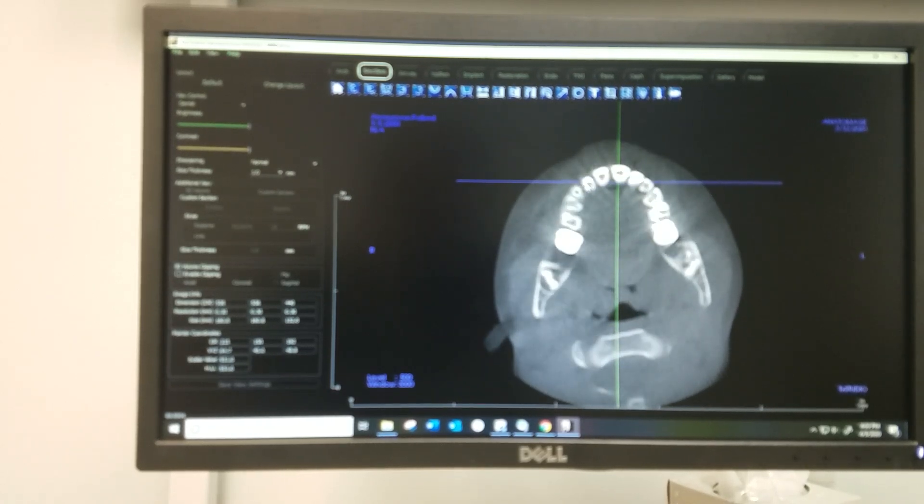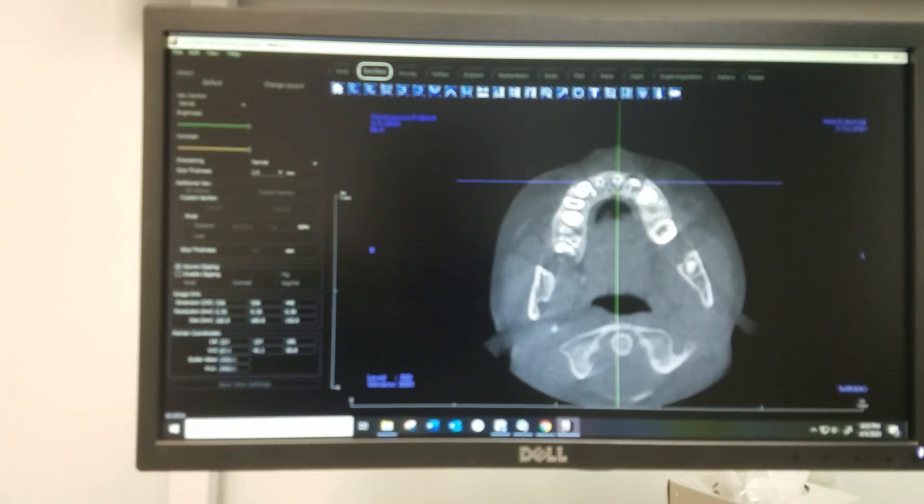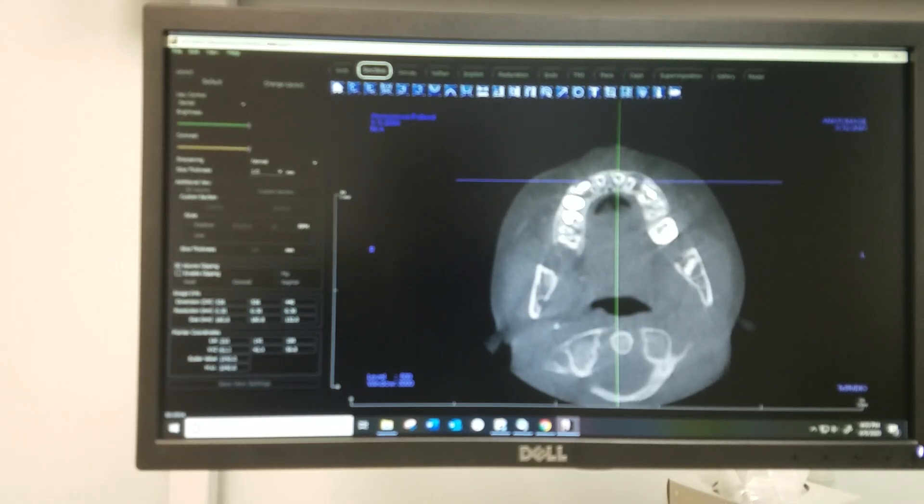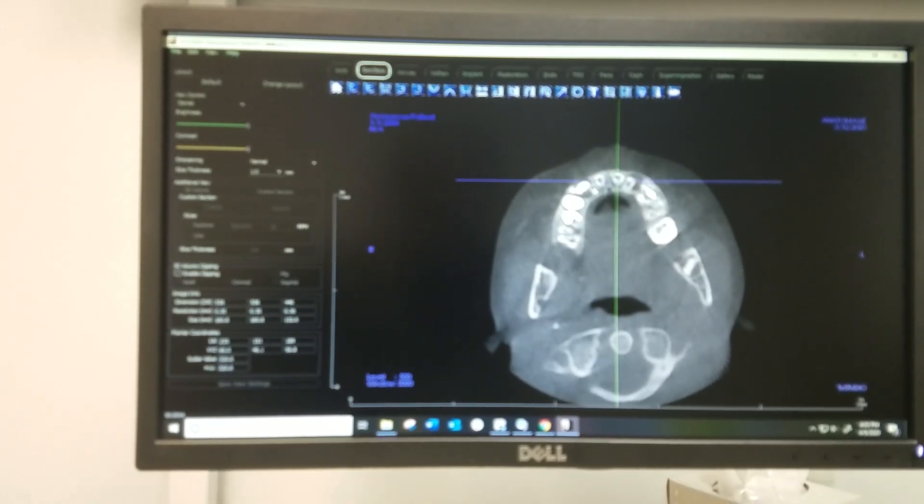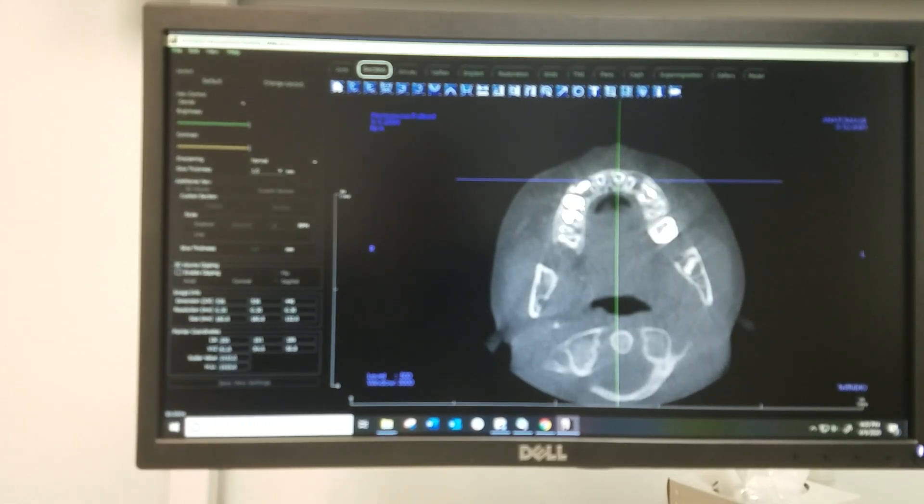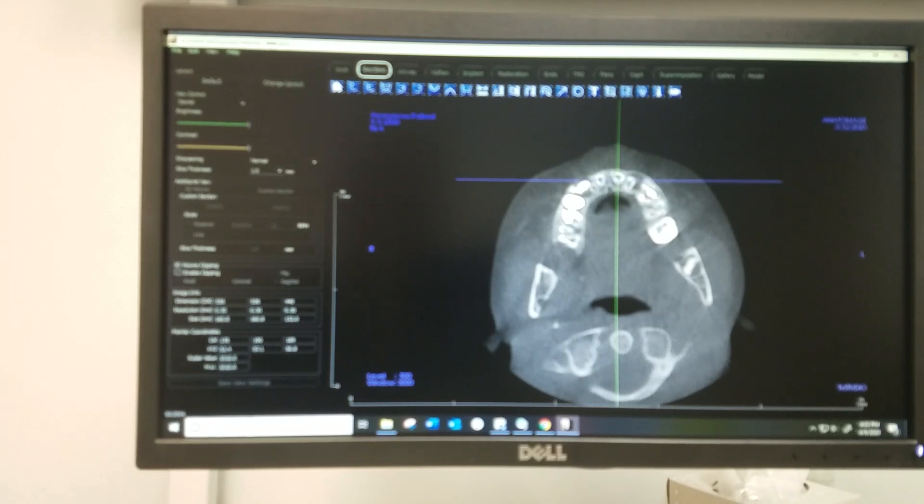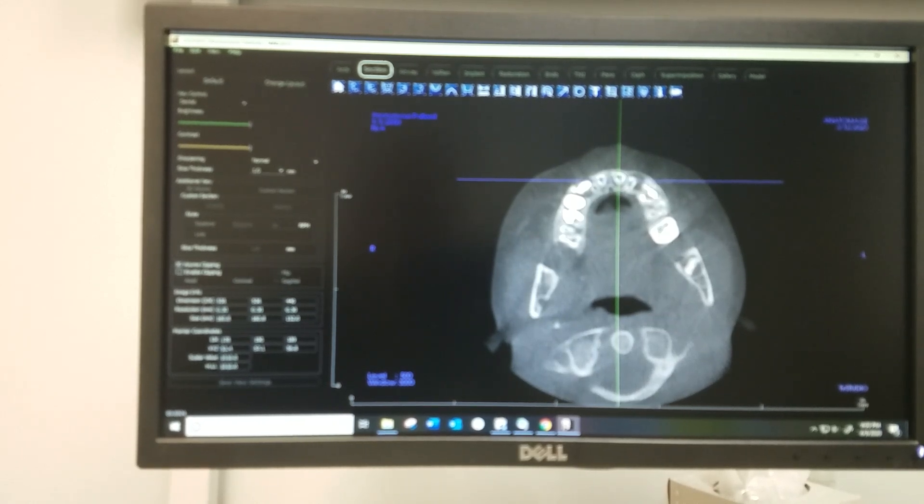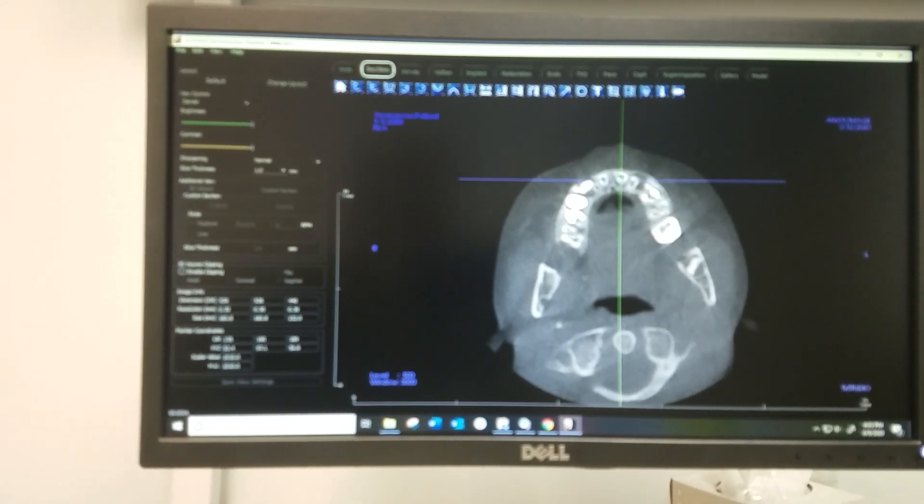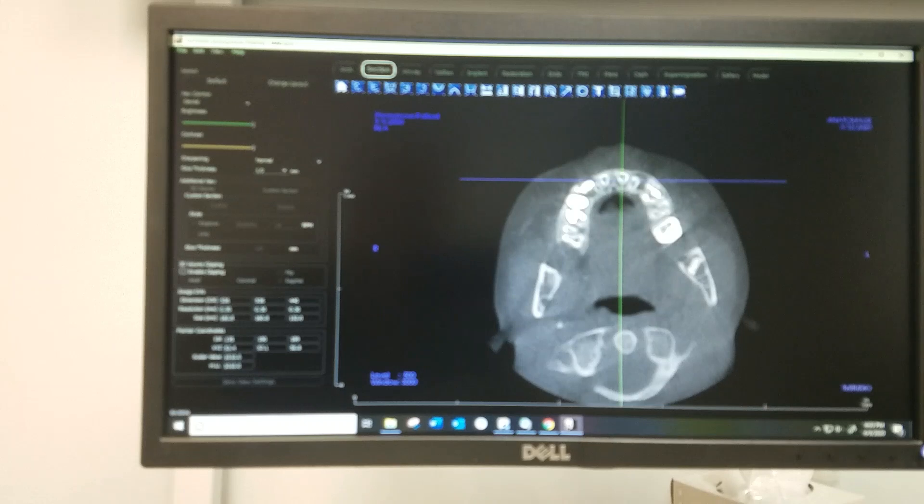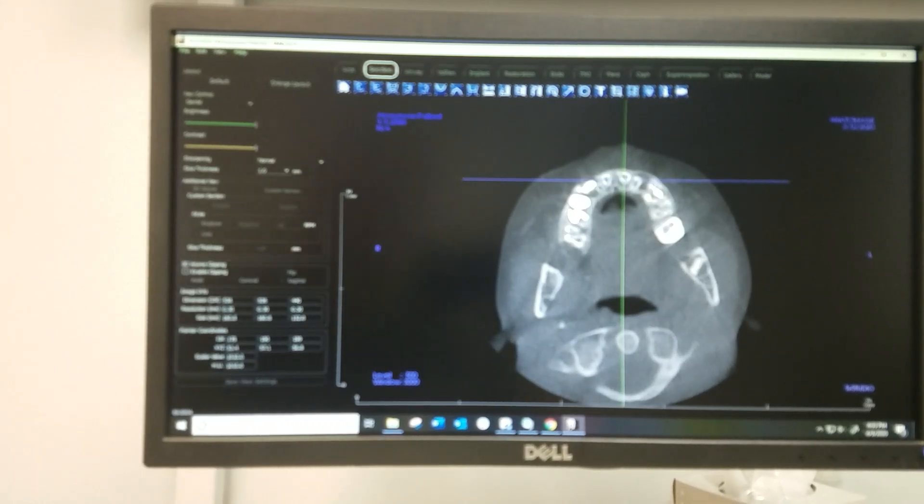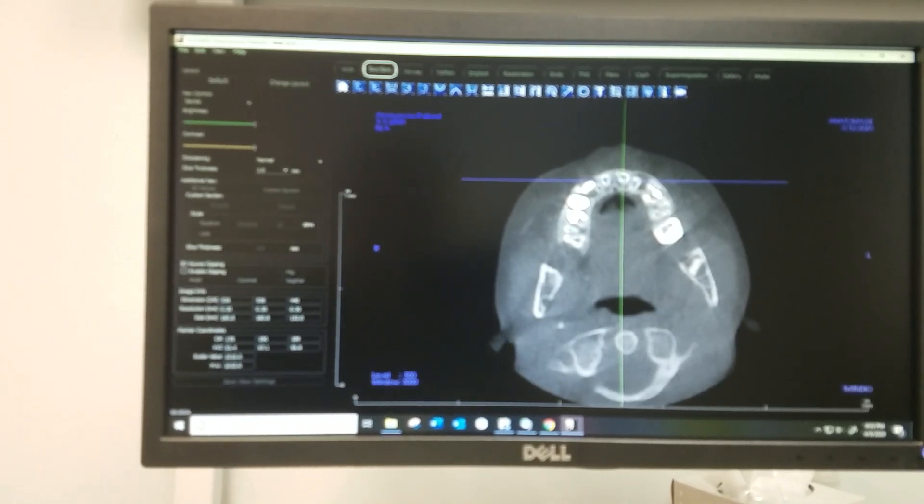Yeah, that's a little worrisome here. There's the canine, it's pretty darn close. You can see that canine and the root tip there. So that does worry me, and you can see that big follicle on that side too. So we're probably going to recommend some sort of treatment, and it might be just as simple as getting the primary canines out so that those teeth can erupt away from the lateral incisors.